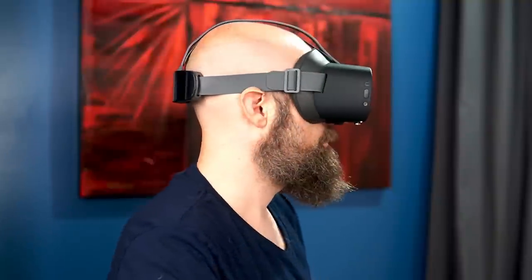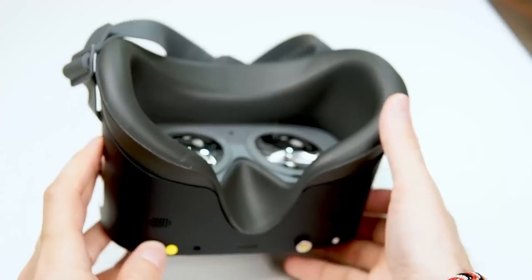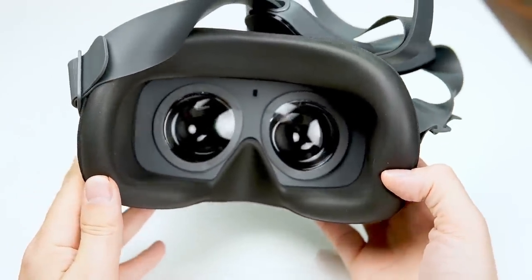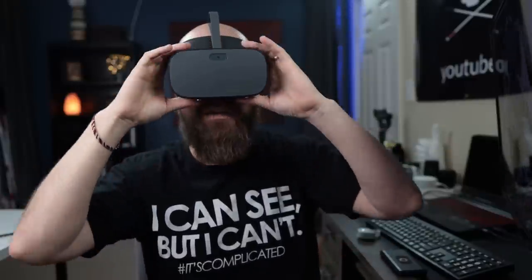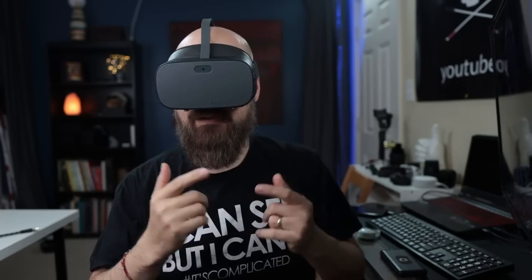The headset weighs 487 grams, or one pound one ounce. It has a lot of rubber-coated padding, which fits pretty well blocking out most of the light. There is a small gap down by the nose but it doesn't cause issues. Battery life gives you about two and a half hours with the internal battery, and using the provided external battery pack bumps that up to over five hours.